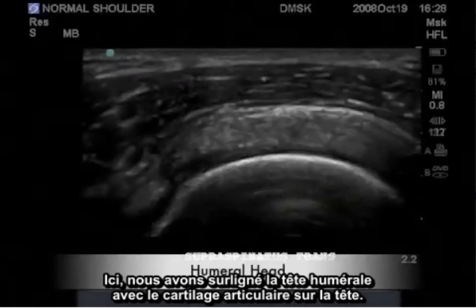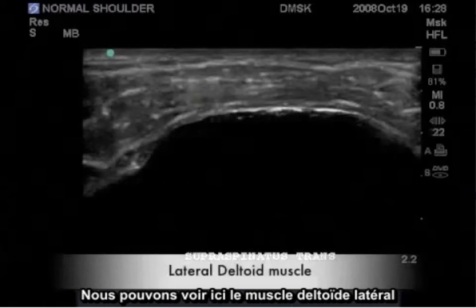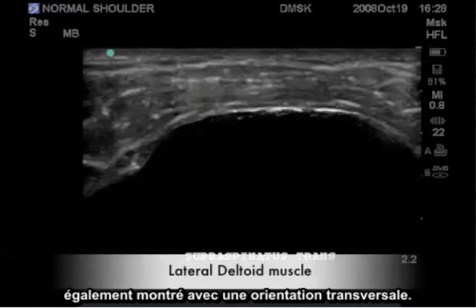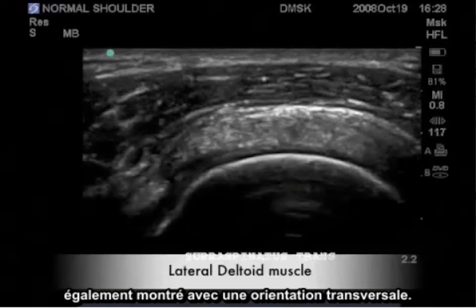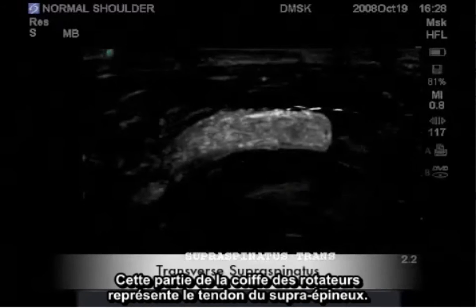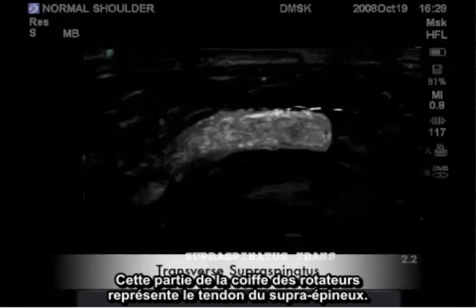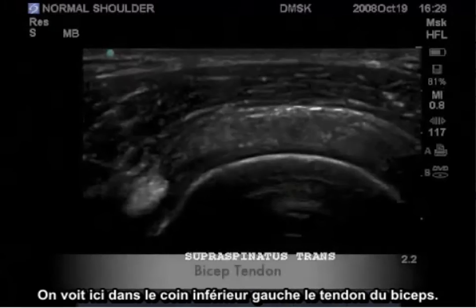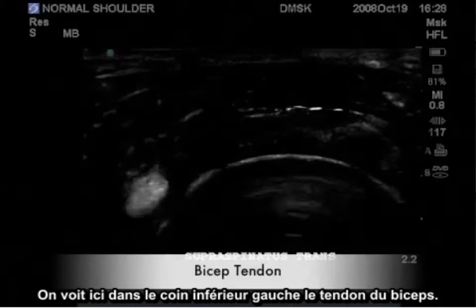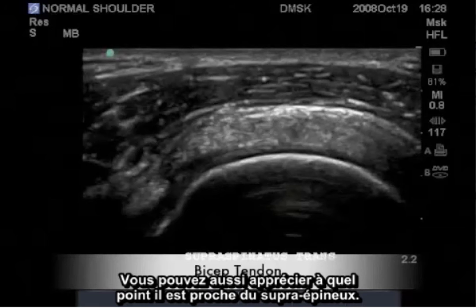Here we have highlighted the humeral head with articular cartilage over the head, and the lateral deltoid muscle also imaged in a transverse orientation. This portion of the rotator cuff represents the true supraspinatus tendon. Shown in the lower left corner is the bicep tendon — you can see how closely it follows the supraspinatus.